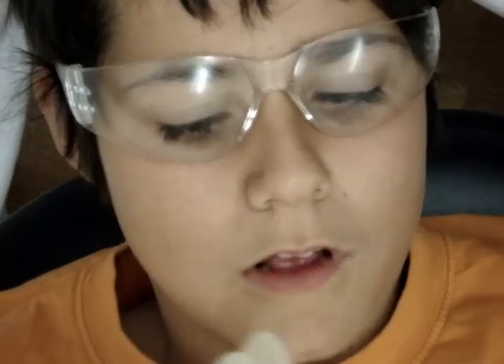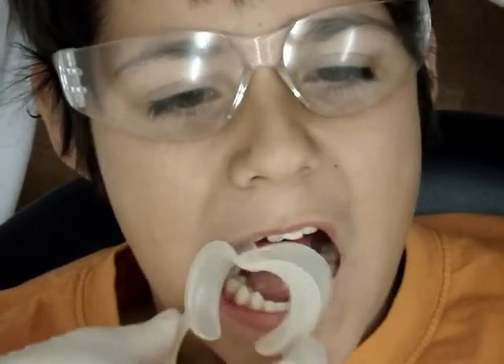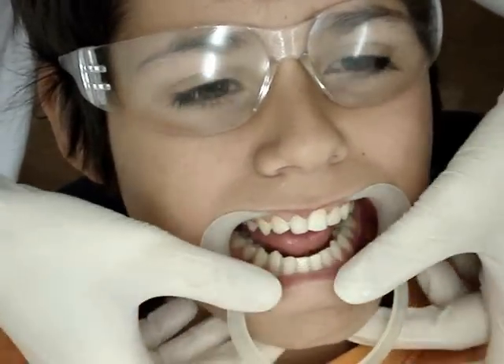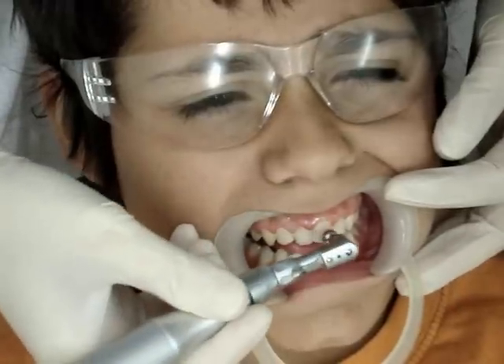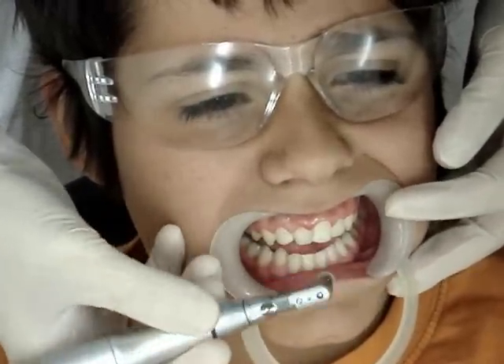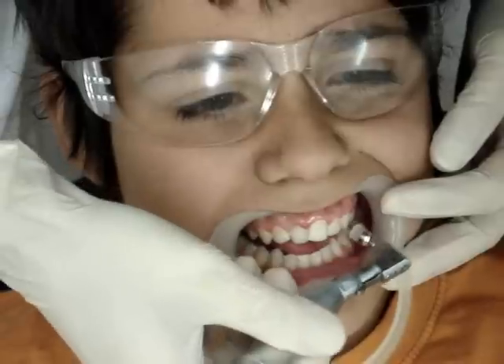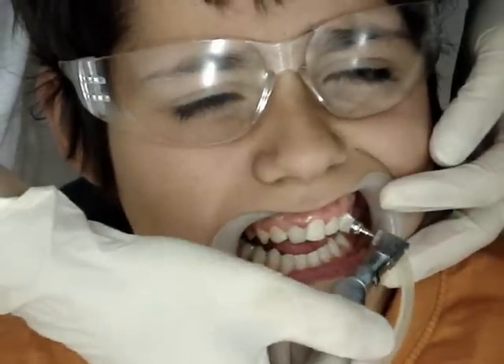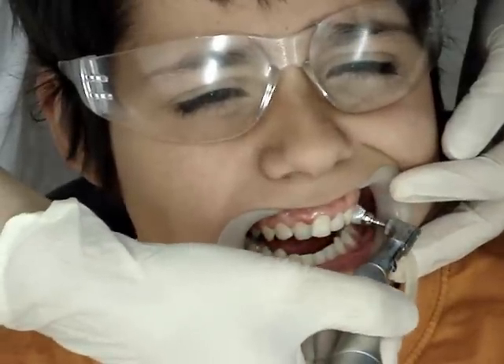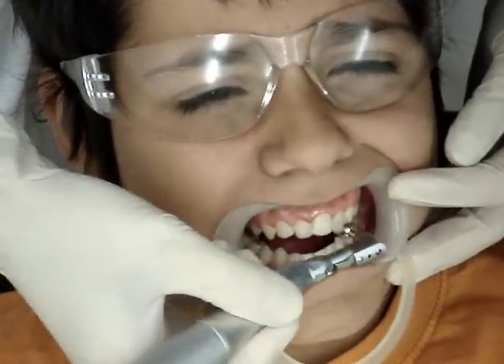We're going to use this cheek retractor to stretch the lips so that we can see in there. Then we're going to clean them. This is to remove any plaque that is present on your teeth to ensure that the brackets stay on for the duration of your treatment.